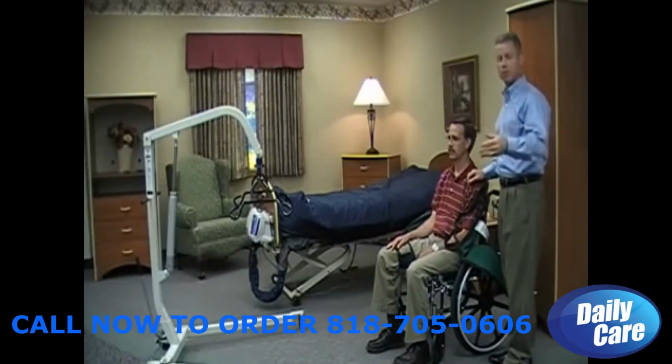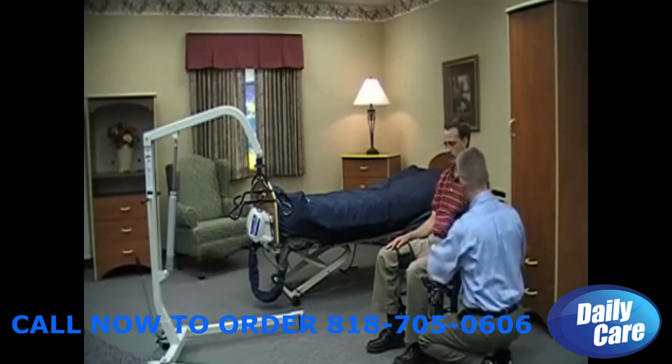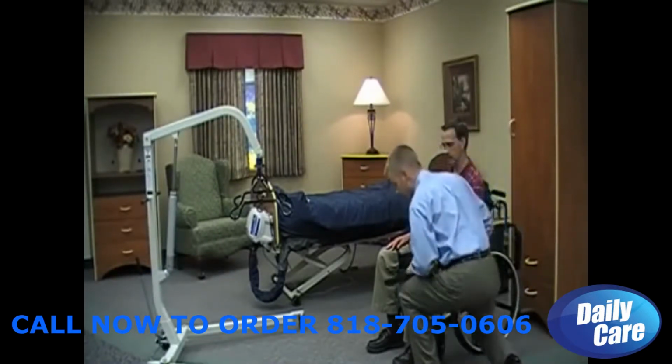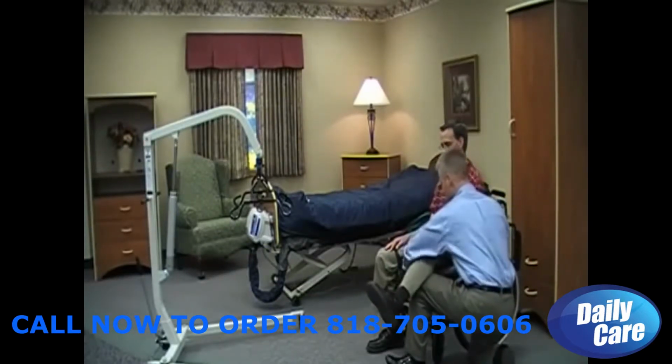In this instance, I'm doing the transfer by myself, but depending on facility requirements, you may have two staff members or two people facilitating a transfer. Now for the left side, you'll see the same thing. Again, I'm going to draw that strap down, ensuring that it's in the proper place, and I'm going to either lift the resident's foot up on top of my foot or their leg up on top of my leg to create that gap so that I can draw the strap down through.